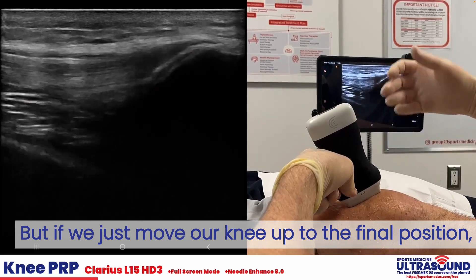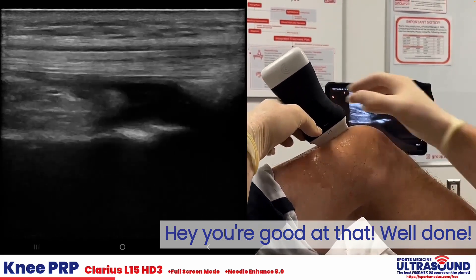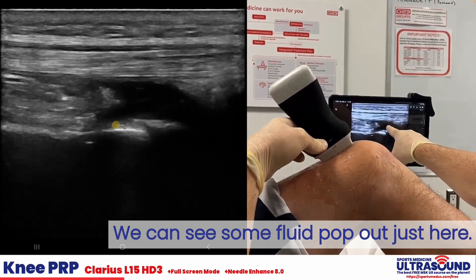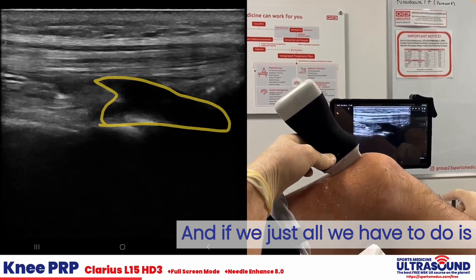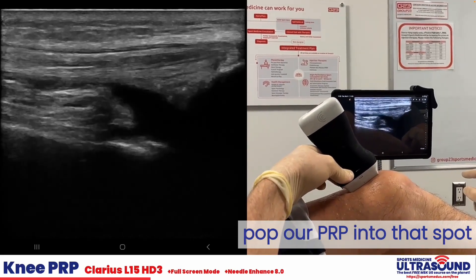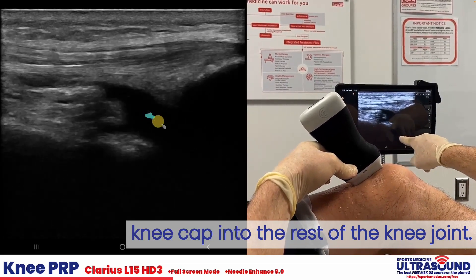If we just move our knee up to the final position, we can see some fluid pop out just here. All we have to do is pop our PRP into that spot and it flows underneath the kneecap into the rest of the knee joint.